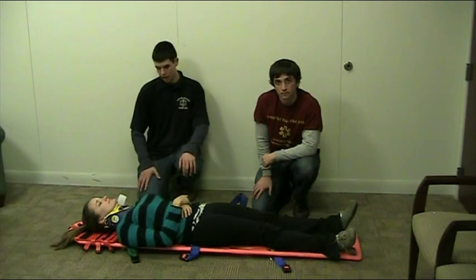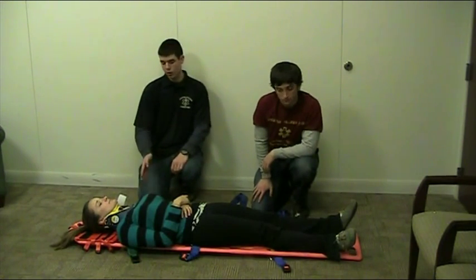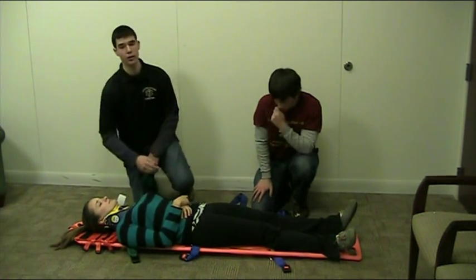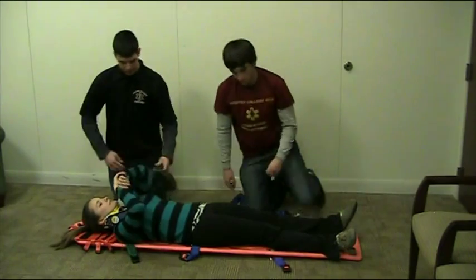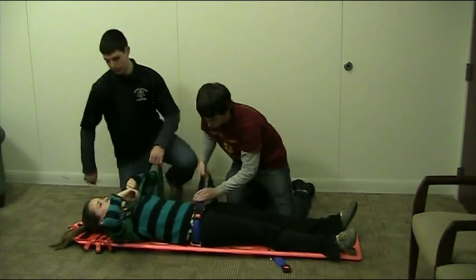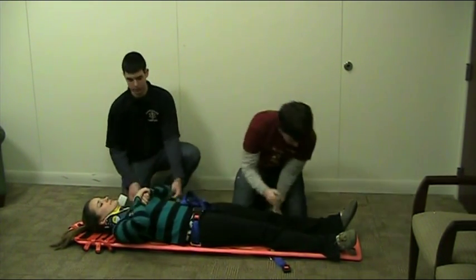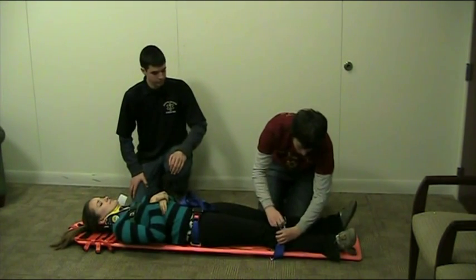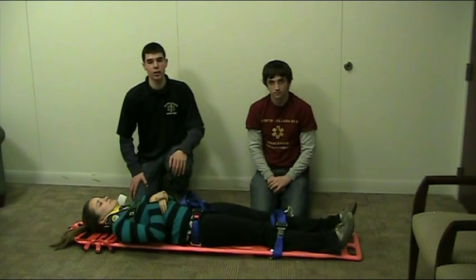Another type of strap that you can use are quick clips. Quick clips are just straps that you clip on to the backboard. Usually you want to use at least three straps: one at the chest, one at the hip, and one at the legs. You can also use four straps, using two at the chest where you cross over. To apply the quick clips, you just snap in and pull. Especially on the chest, it's important to ask the patient to take a deep breath in and a deep breath out, and strap upon exhalation. You can also tuck the straps in so that they are not in the way. That is how you properly secure someone to a backboard with quick clips or other straps.